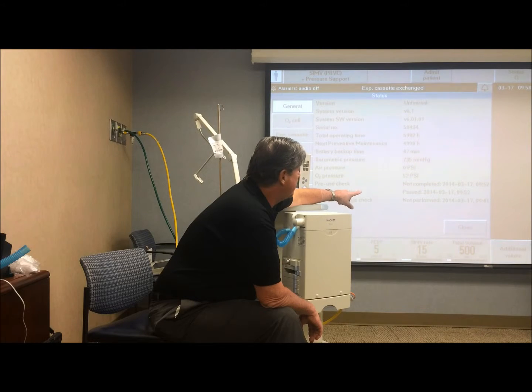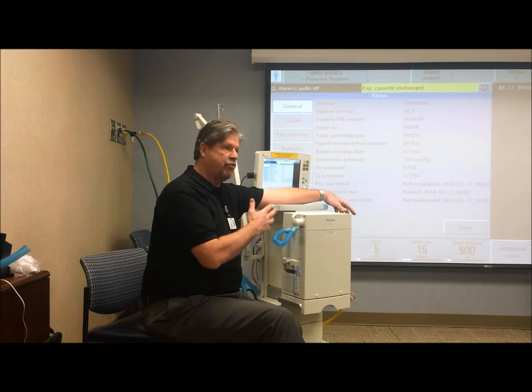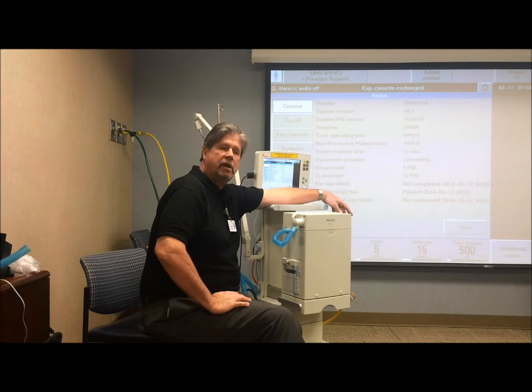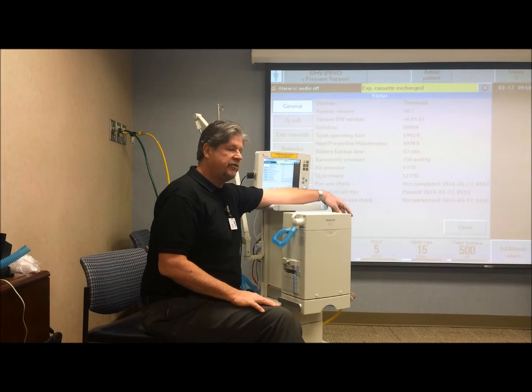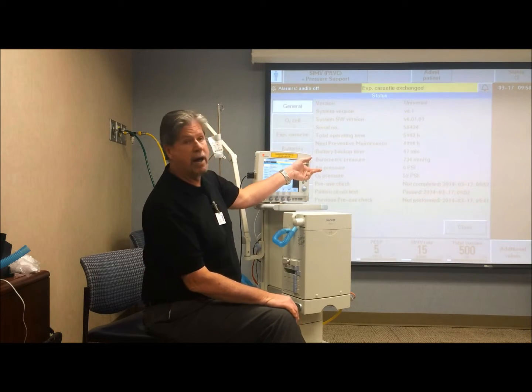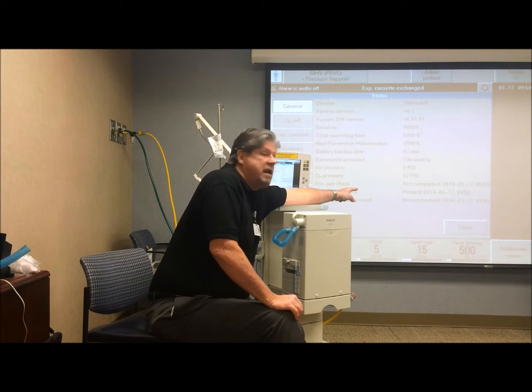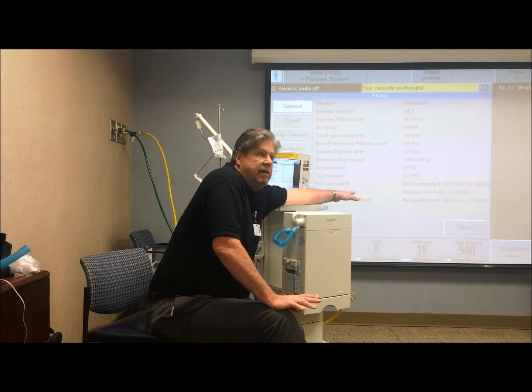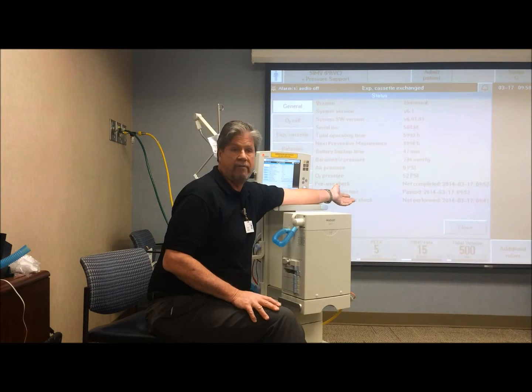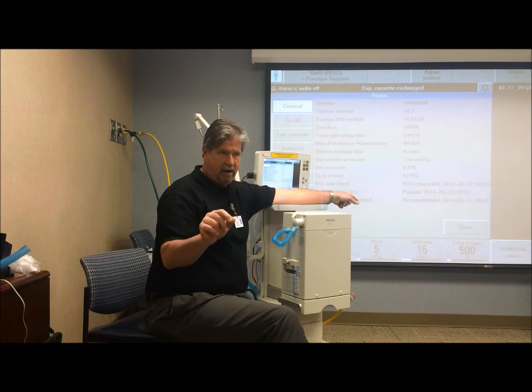And then the last one, that's how you could go in if Mr. Joint Commission comes up to you while you're running the ventilator on a patient and says, did you do a pre-use check on this patient before you put it on the ventilator? And you can say yes, and he might say, well, how do you know that? Well, you could just press this key while the ventilator's running and point to the previous pre-use check, which would say in normal circumstances, performed on February 14th or whatever. It will only do that one time in turning the ventilator on and off.